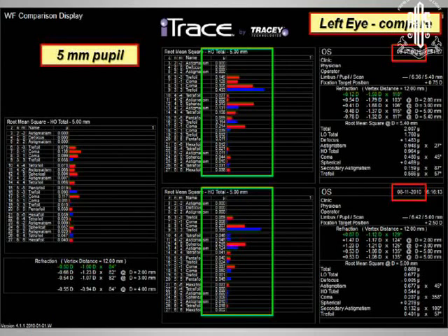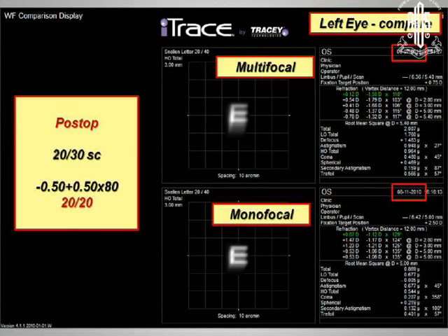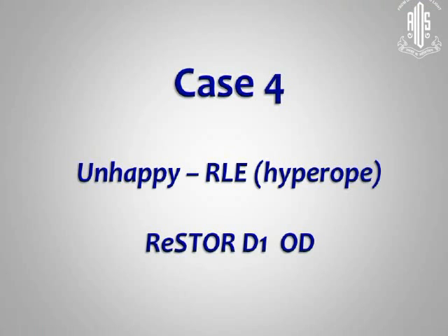Well, she came in a week later and said, amazing, I can tell, it's 4 months now, I can tell it's dramatically better. I can't read at all up close, but I'm so happy because it's clearer. And she wrote up a wonderful review on Yelp about our practice. So you can see that she still has aberrations, but how it is less without the multifocal. And this is a comparison, her aberrations with the multifocal, with the monofocal, with that post-LASIK cornea.